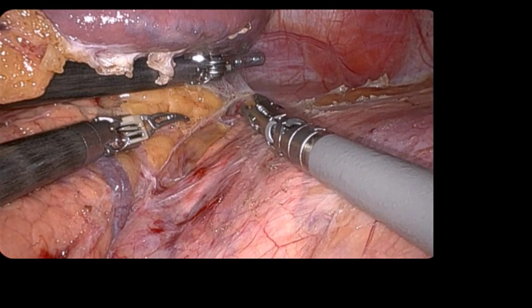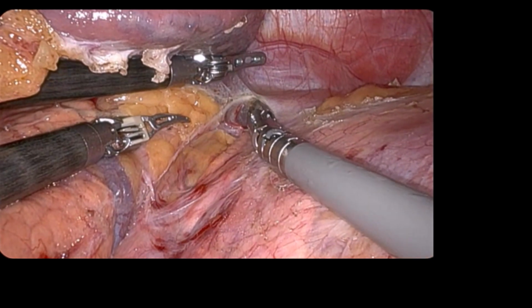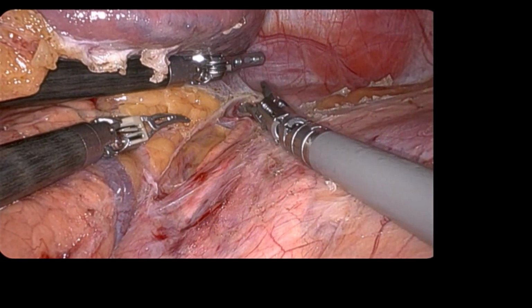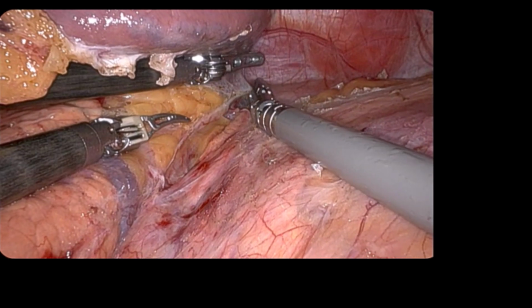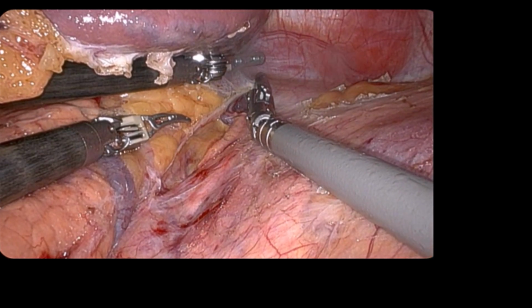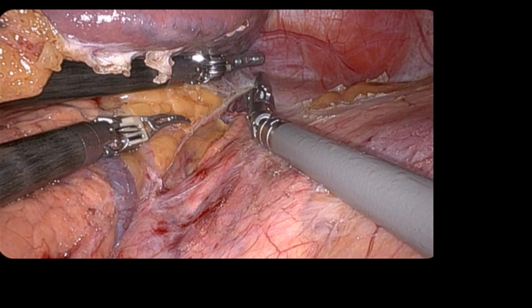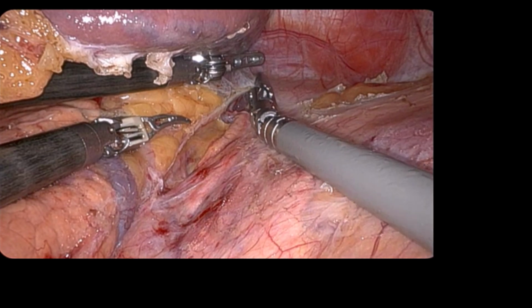If you have the personnel who have the ability to utilize the paddle retractor from the bedside while you, the surgeon, are on the robotic console, some will do that. However, I find that the nuances of using the paddle retractor, as well as the safety of being able to place it in the way I would like to, preclude that, and I end up using the tip-up. If need be, I go back to the bedside and complete the operation without robotic assistance, although that's rare.